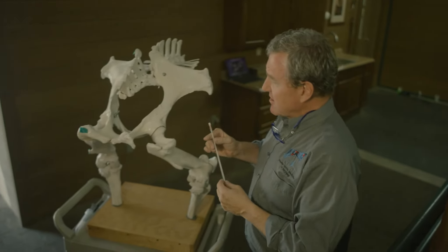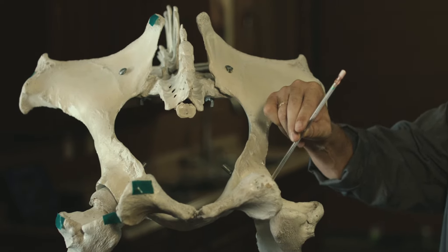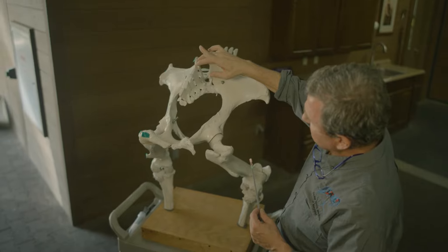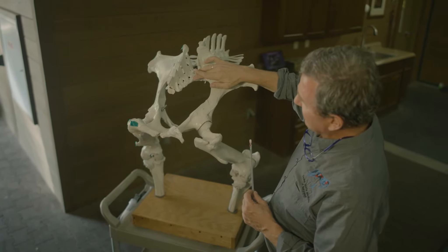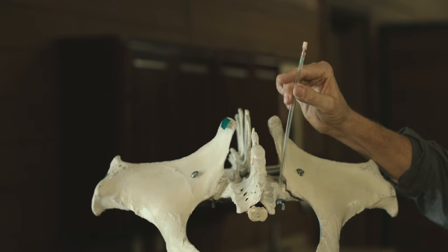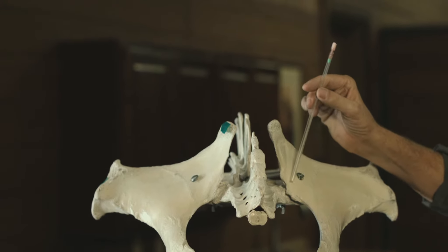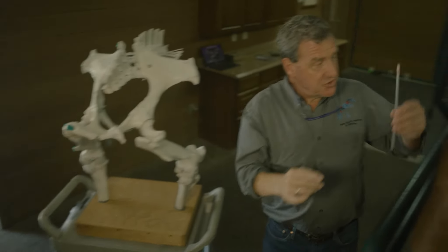Transferring over to our specimen, the hip joint is here and you're going to be passing your needle down to the hip joint in roughly this aspect. The sacroiliac joint will be approached directly from here. By tunneling down your vision through the sacrum it looks like a J-shape — the cranial or dorsal aspect here, the lateral aspect here — and this lateral aspect is the insertion point for the dorsal sacroiliac ligament, the membranous portion, which comes down from the apex to the lateral aspect. Your needle has to get outside of that, or it will just be an intramuscular injection into the sacral caudalis muscle lining the sacrum. You will image the caudal aspect of the ilium where it meets the sacrum and your needle will pass directly down here, which correlates to our patient.